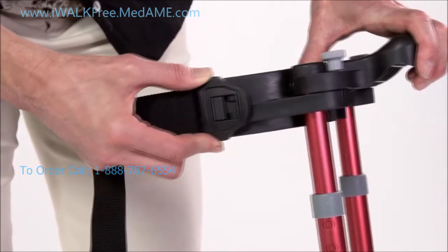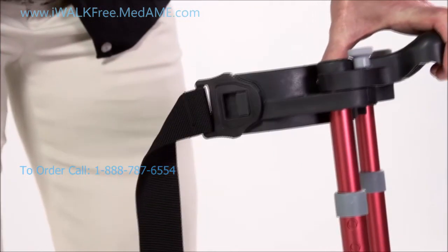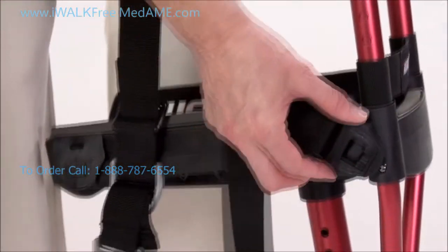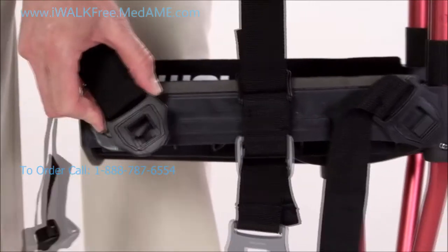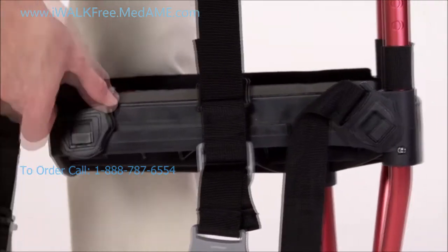Now install the three straps onto the crutch, starting with the black buckles on the inside of the crutch. Let's pull the comfort pads out of the way for now and slide the calf strap to the back of the platform.